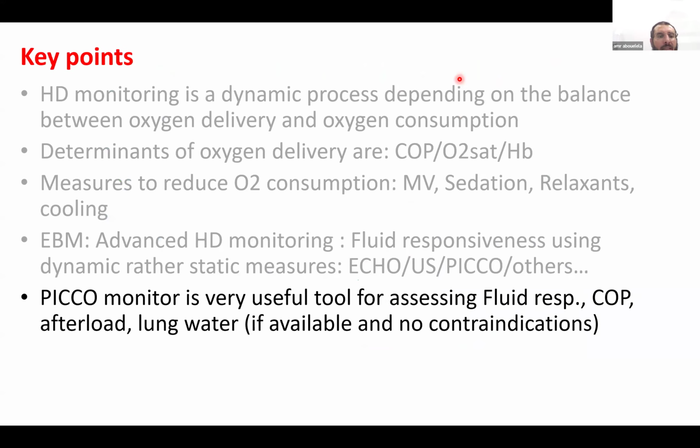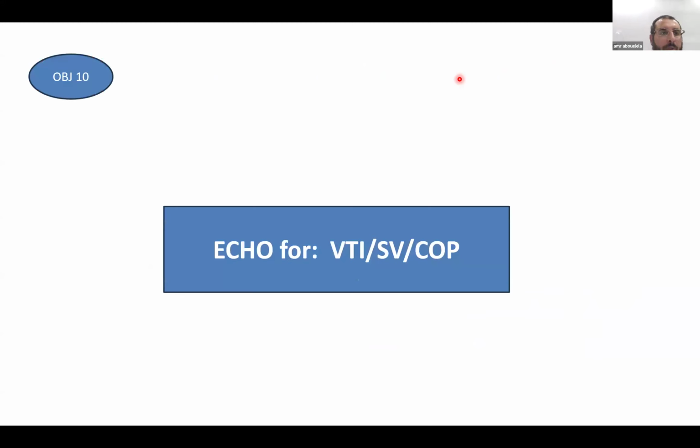So another key point, the PICCO monitor is a very useful tool for assessing fluid responsiveness, the cardiac output, and extravascular lung water, if available, you monitor, and you have no contraindication to use it.